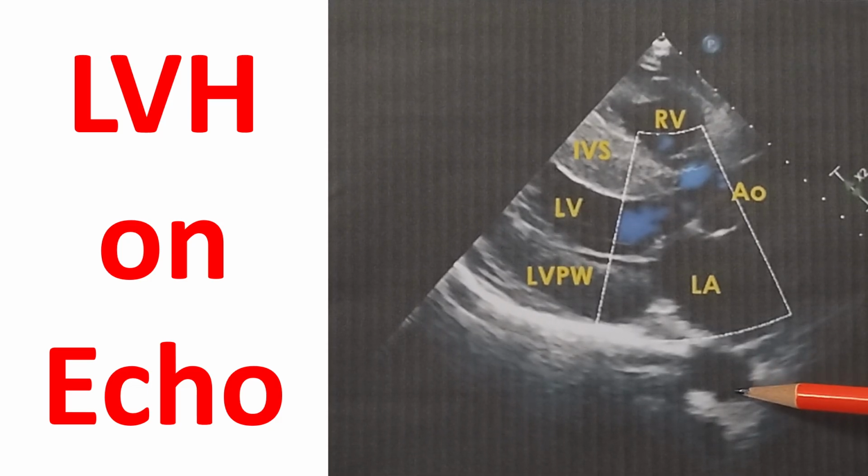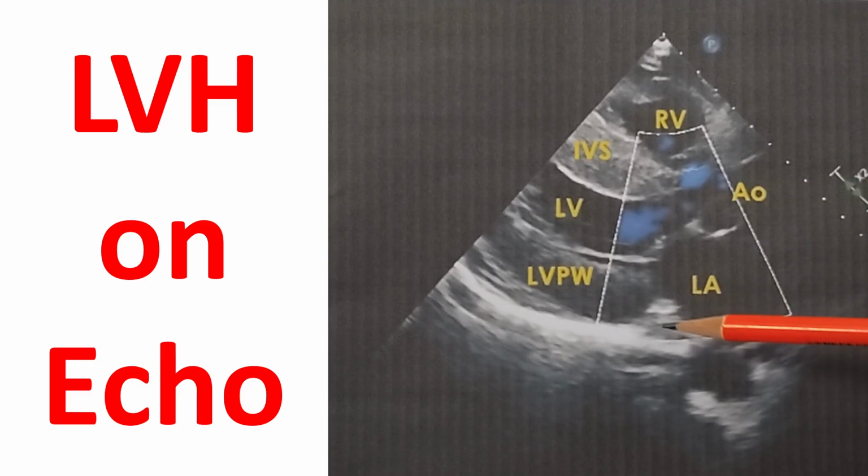This is the cross section of descending aorta. This is ascending aorta. This is descending aorta. You can see part of the coronary sinus also here in the atrioventricular groove. Some sonolucency is seen there. If the coronary sinus is dilated, as in left superior vena cava draining into the coronary sinus, then this region can be bigger.